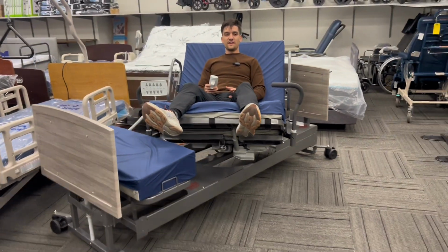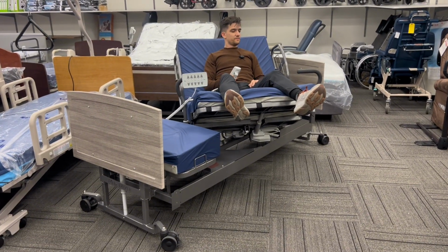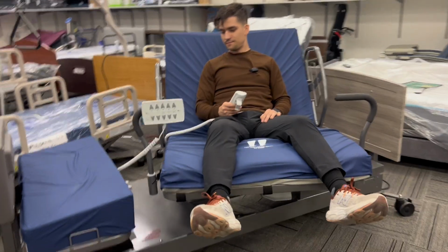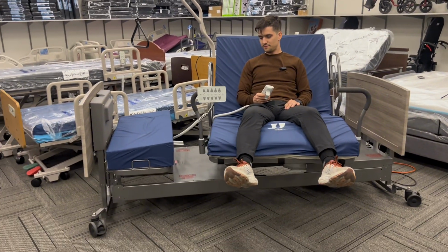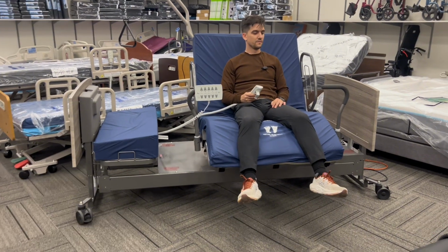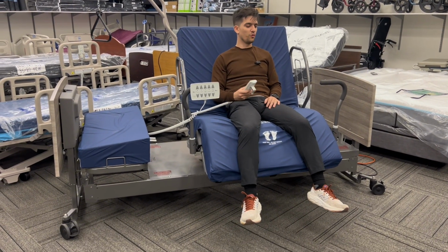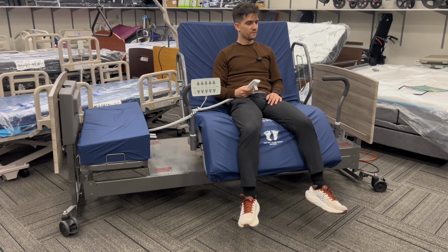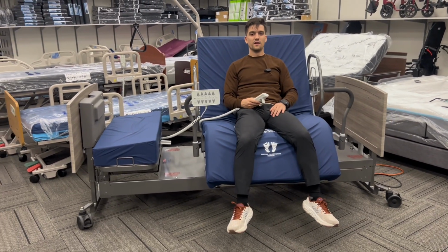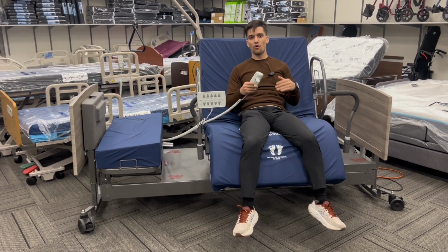The movement here again is nice and slow. Now it's fully tilted. I'm going to keep holding it. All right. So I stopped here. I purposely stopped here because in this position, you are also seated.